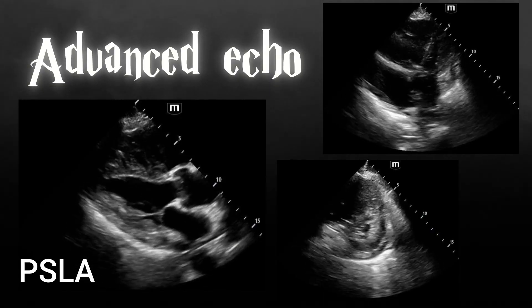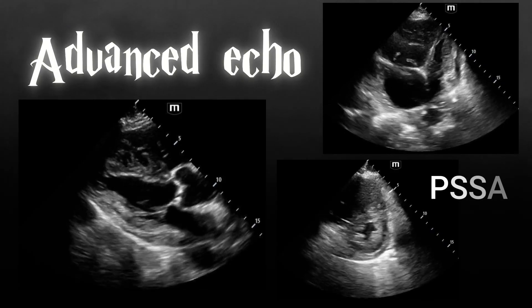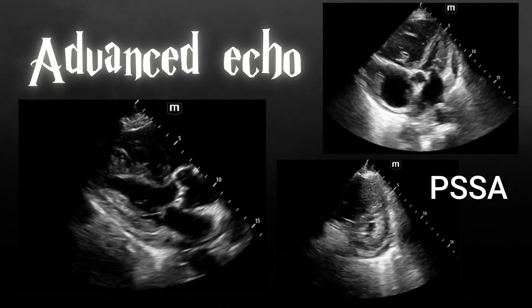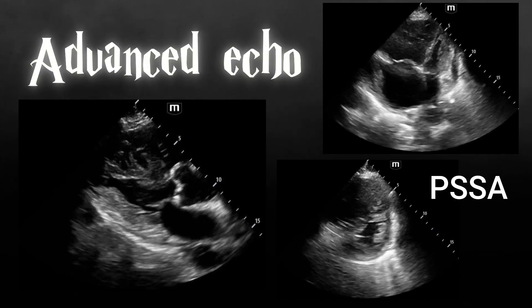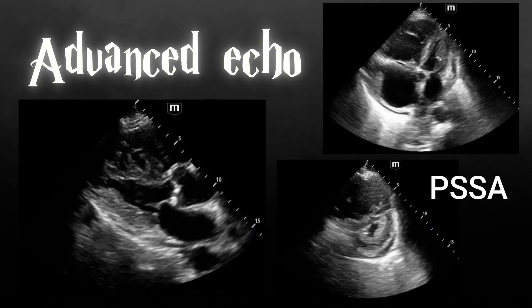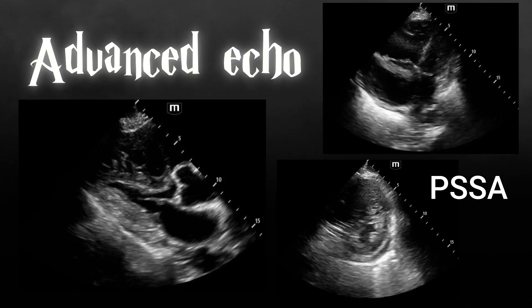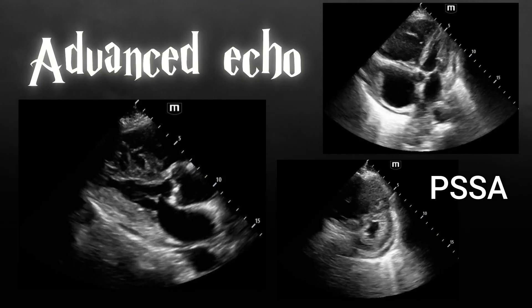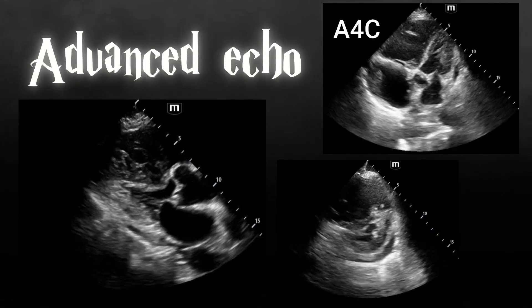The left ventricle appears to be contracting normally, so it has a normal left ventricular ejection fraction. However, the RV looks a little bit generous. Moving on to the parasternal short axis view in the middle, we'll notice that the RV is very large, and it is actually flattening the interventricular septum, causing what we call the D sign on the left ventricle.